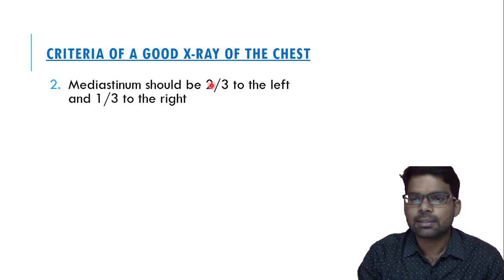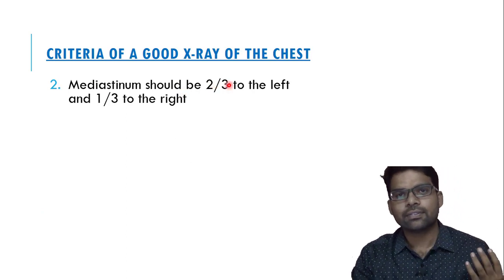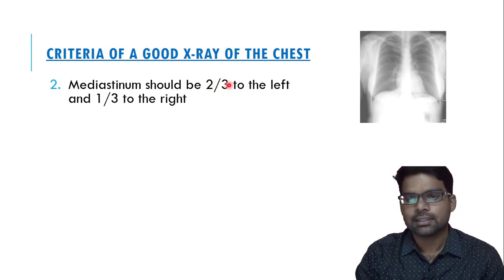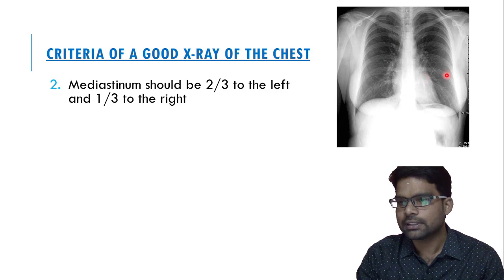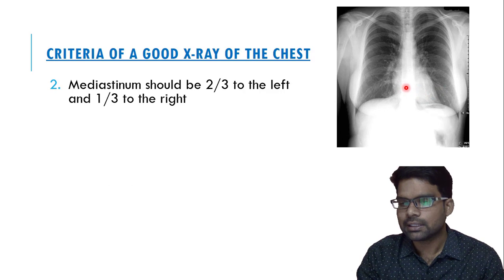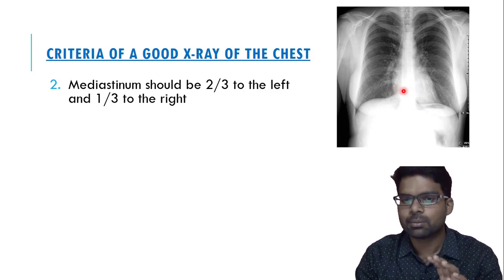The second point: the mediastinum should be two-thirds to the left and one-third to the right. In this normal chest X-ray PA film, if you look at the mediastinum, two-thirds is to the left and one-third is to the right, which confirms it is a normal and good X-ray projection.